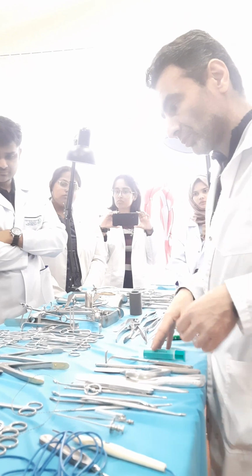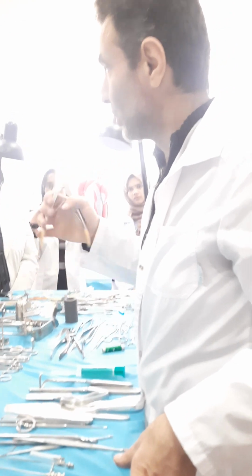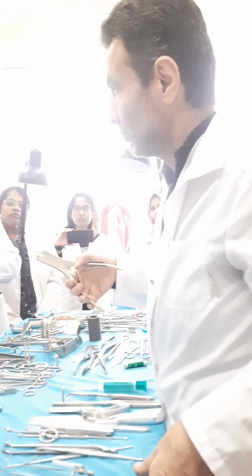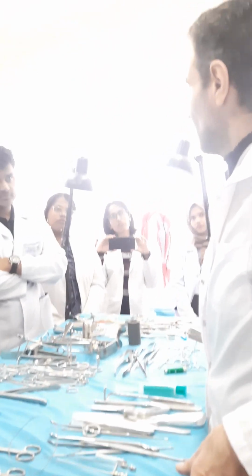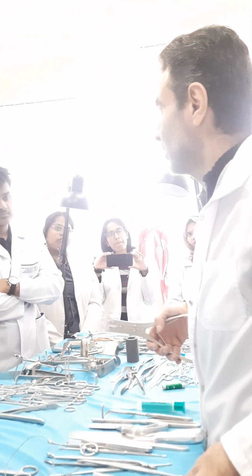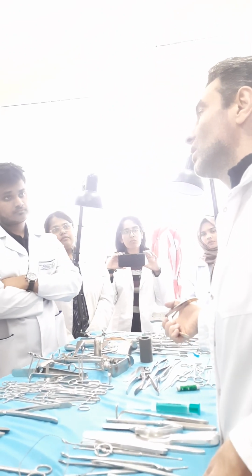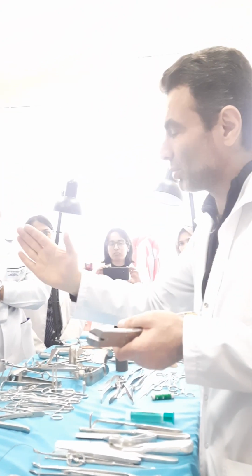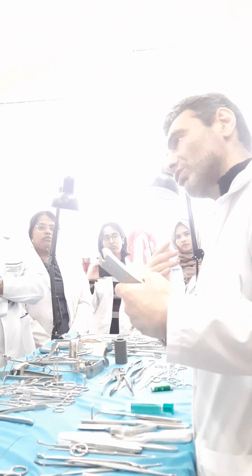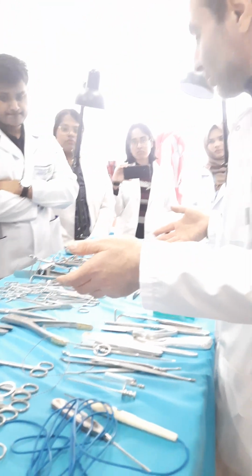Okay. So, can you repeat what this one was? This is the bone cutting forceps. These forceps we use primarily to cut the ribs. Sometimes you can cut other parts of the flat bones, for example, the wing of the iliac bone. We can use it, for example, for some transplantation where there are skull defects. You can take it and split it into two compact layers and use it for plastic reconstruction. In the future, we will study it. I mean, we will study these surgical performances.